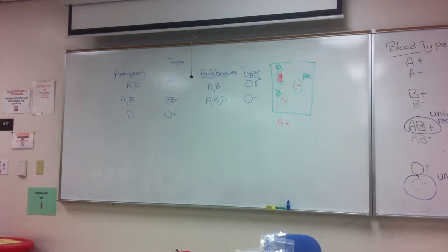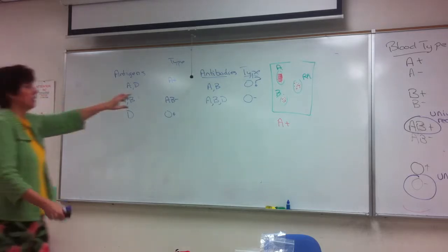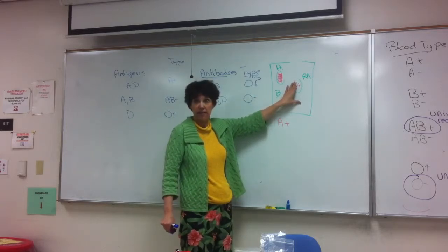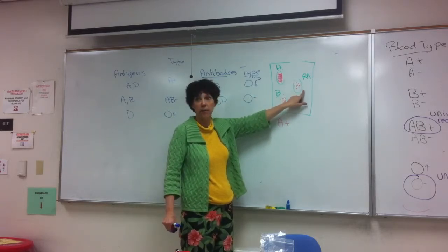So today in lab, we're going to be testing for the antigen. We're going to be using antibodies to do it, but we're going to be looking for the antigen. So the reaction on this up here, this is the presence or the absence of the antigen. So you'll definitely know, negative or positive.